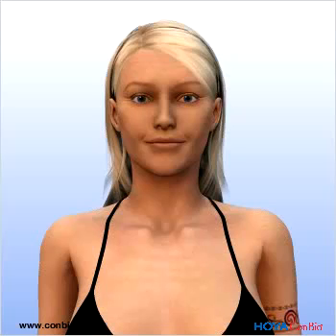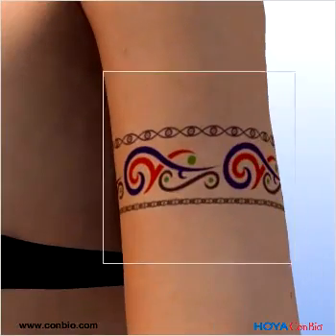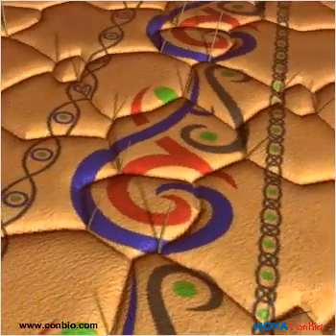The Medlite C6 and Revlite are truly the gold standards in laser tattoo removal. Advanced Q-switched engineering offers safe, effective treatment of tattoos on all skin types.